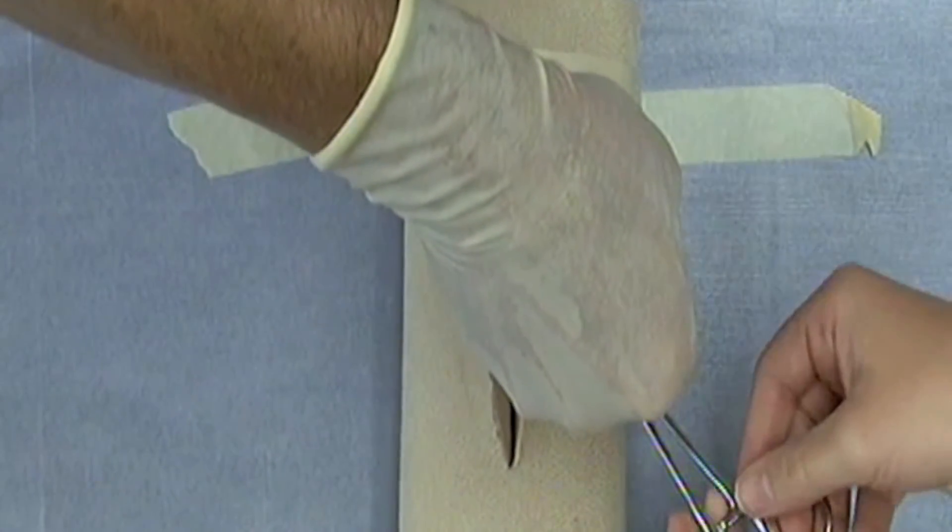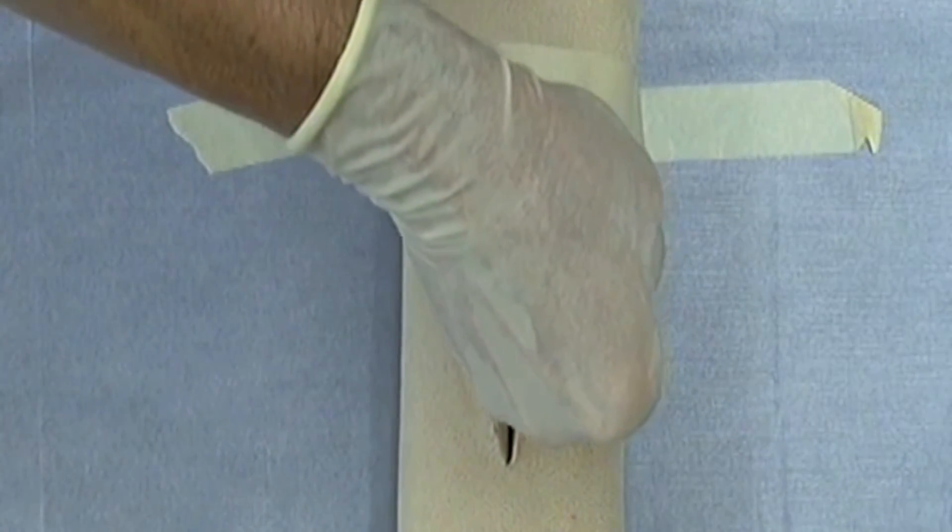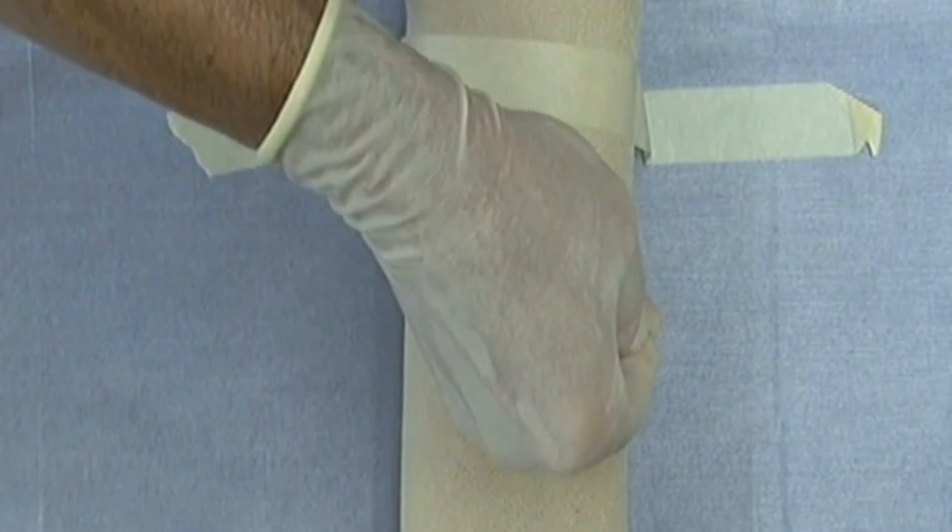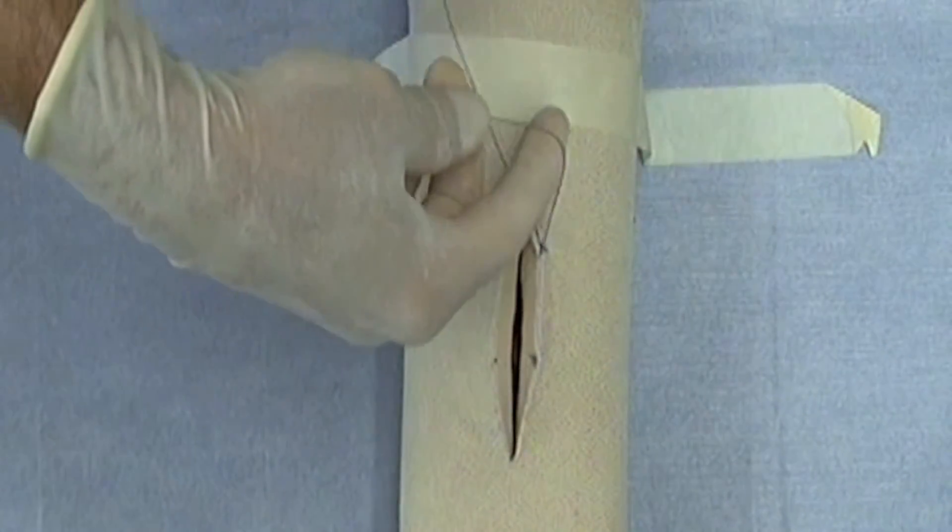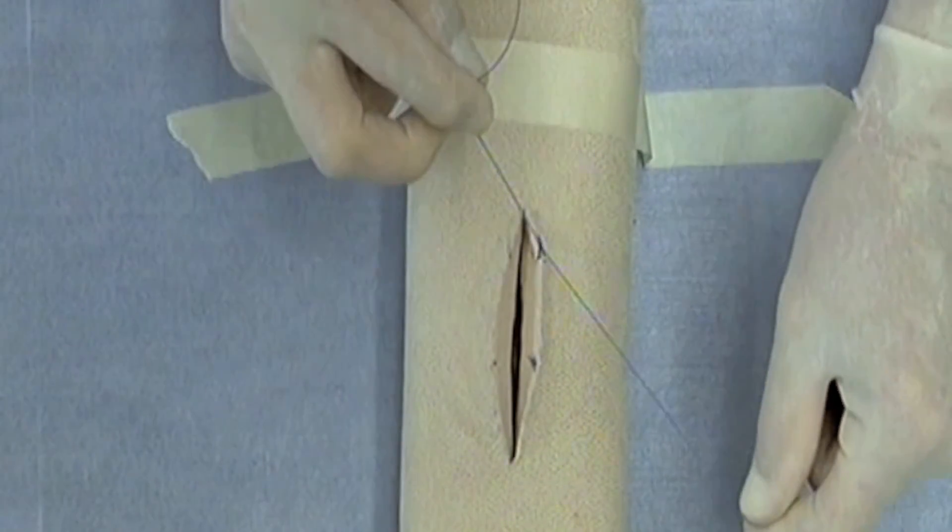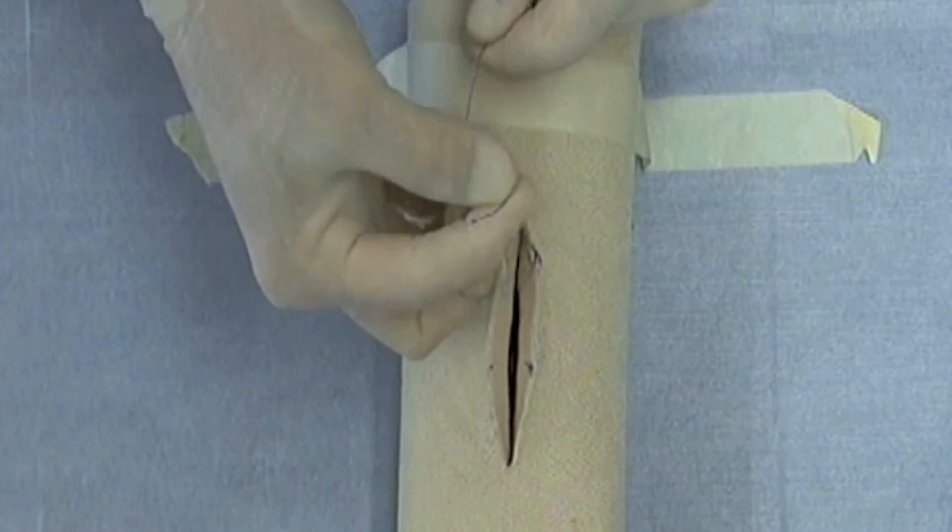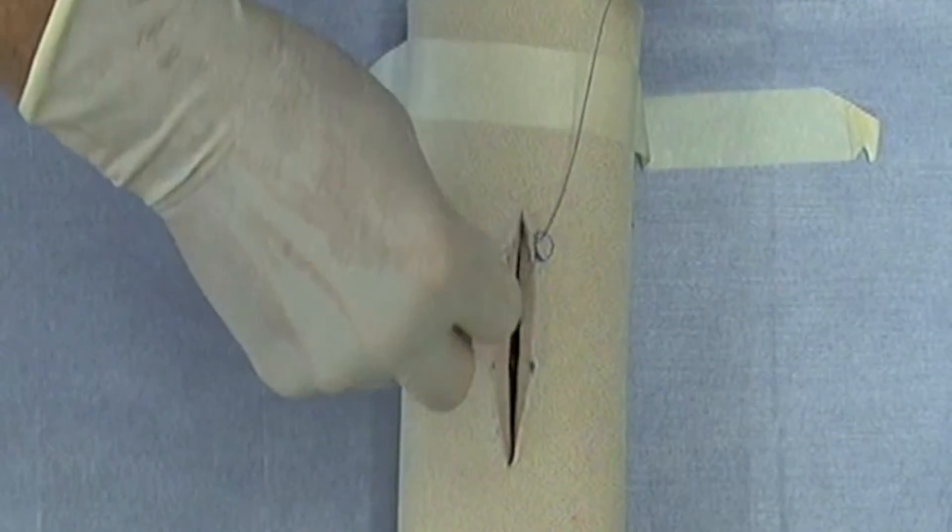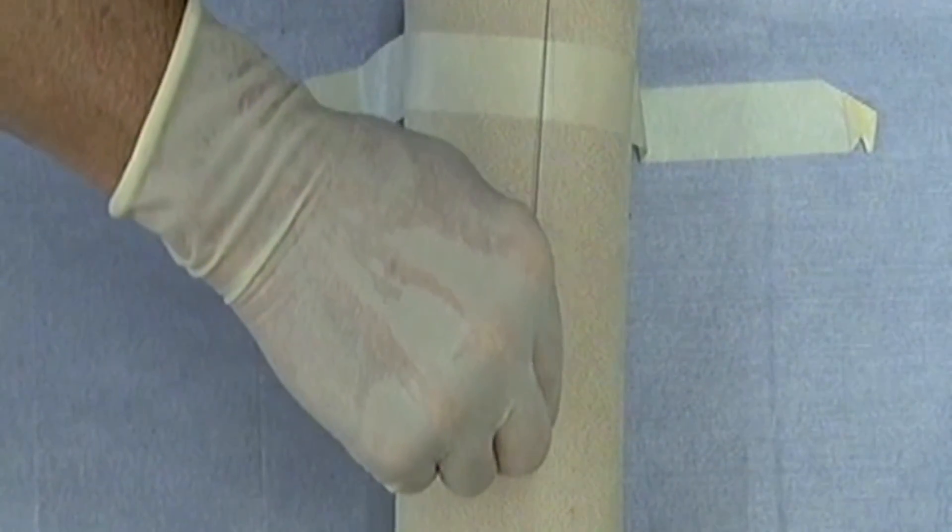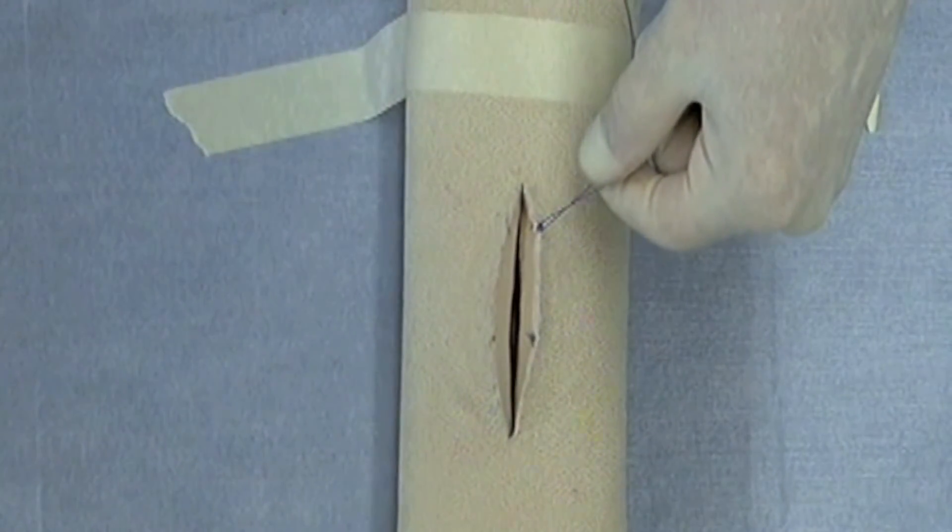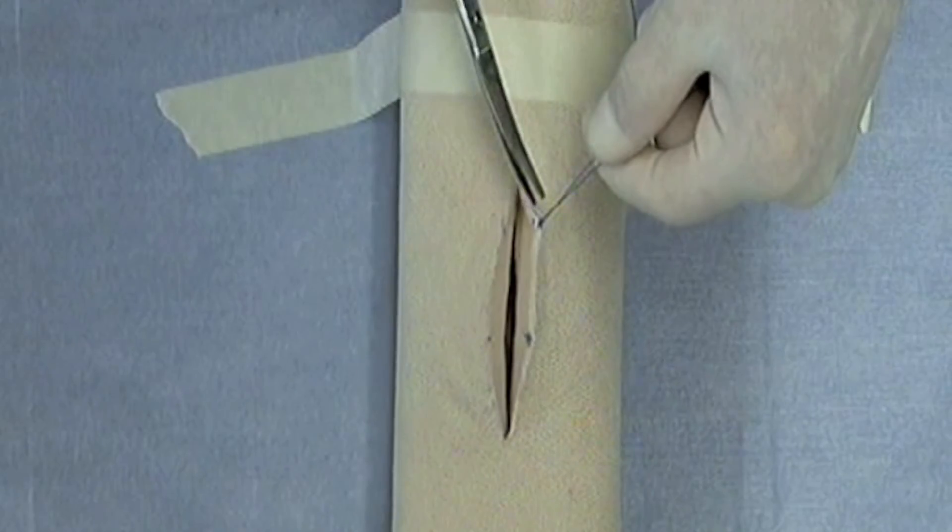Okay, the assistant surgeon is going to release. I'm going to snug the suture material into the surrounding tissue, completely occluding the vessel and then complete the square knot. I'm going to put one additional throw on top. So I've performed a square knot with a right-hand one-hand technique with one additional throw.